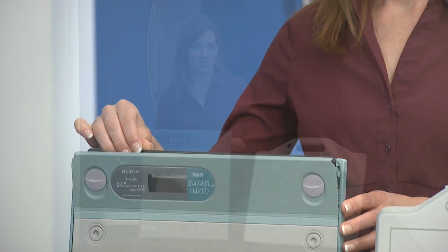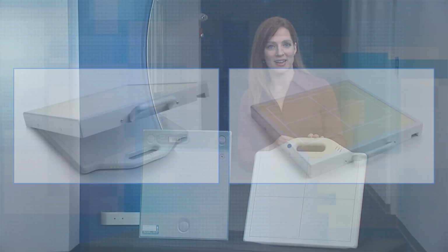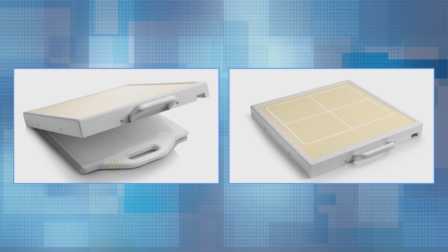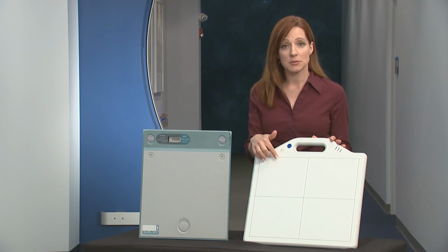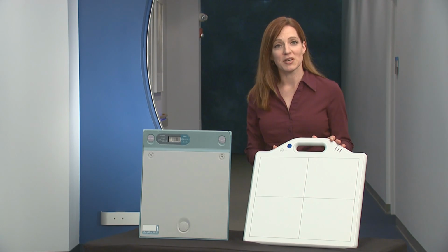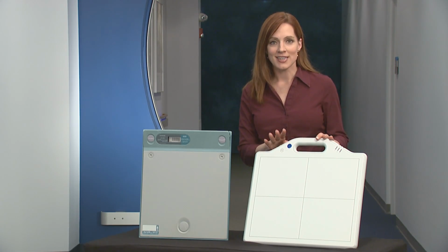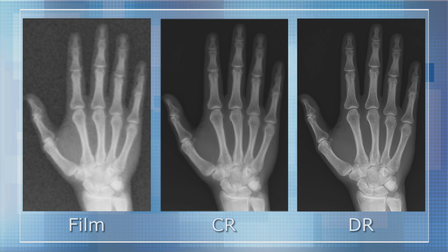The latest technology, which is starting to replace CR, is DR, or digital radiography. With DR, there is no plate to process and no cassette to eventually fail. The receptor stores the actual image as it's being taken, which can then be uploaded to a computer. Digital radiography has a resolution 10 times that of CR, which is 50 times better than traditional film methods.